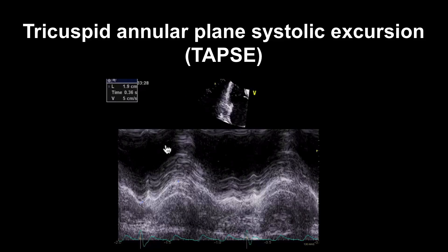We have two ways of looking at the longitudinal function of the right ventricle. One of them is TAPSE — the tricuspid annular plane systolic excursion. We measure this on a zoomed M-mode at the lateral side of the tricuspid annulus, looking for a really clear echo visible throughout systole. We measure this distance — in this case it's 1.9 centimetres — and anything above 1.6 centimetres we would consider normal.